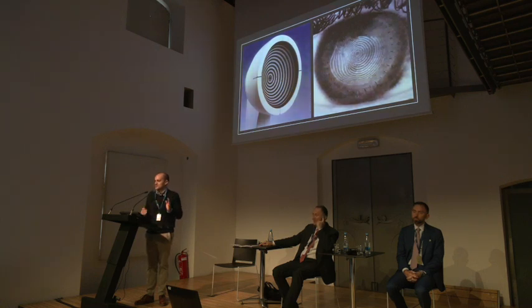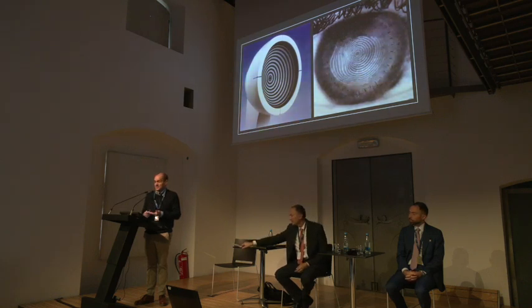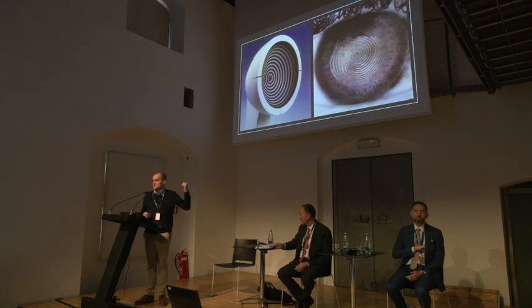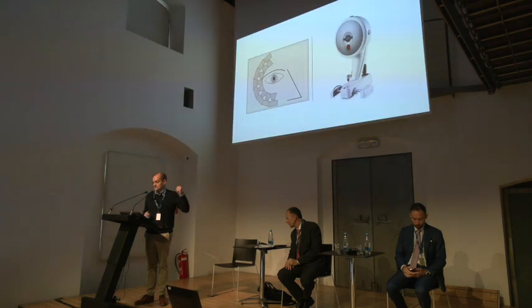Placido can be used for many things. Diagnostics, it can be used for tracking, but it doesn't tell you anything about the back surface, or it doesn't tell you anything about the eye if there's any sort of a surface problem. You have bad dry eye, this is not going to be useful. But it's better than Scheimpflug if you're talking about keratometries or instant.